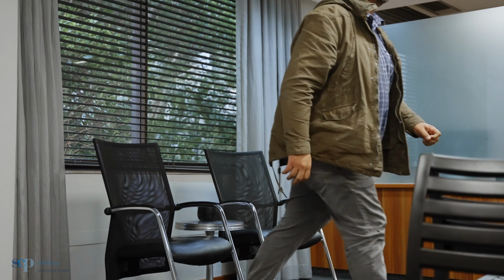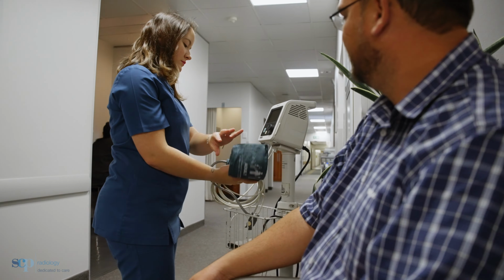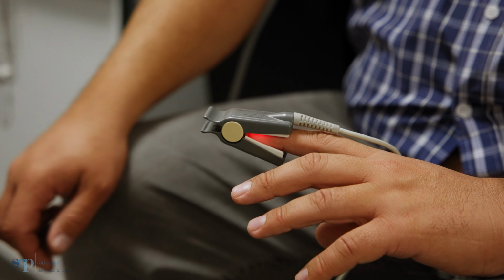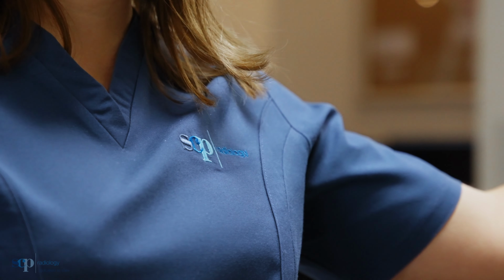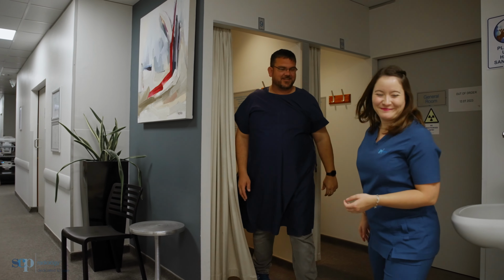For a cardiac scan, it's very important that we get your heart to a specific state so that we can produce good quality images for the doctors to pick up any problems. When your heart is beating too quick, it's more difficult for the scan to capture the heart in that specific moment. You come for your appointment on the day, we take your blood pressure and ask you a couple of questions about your medical history. Then we'll take you into our CT room for the scan.